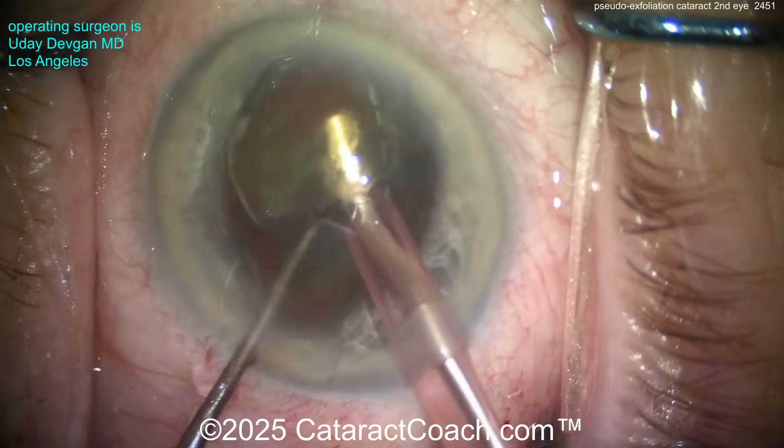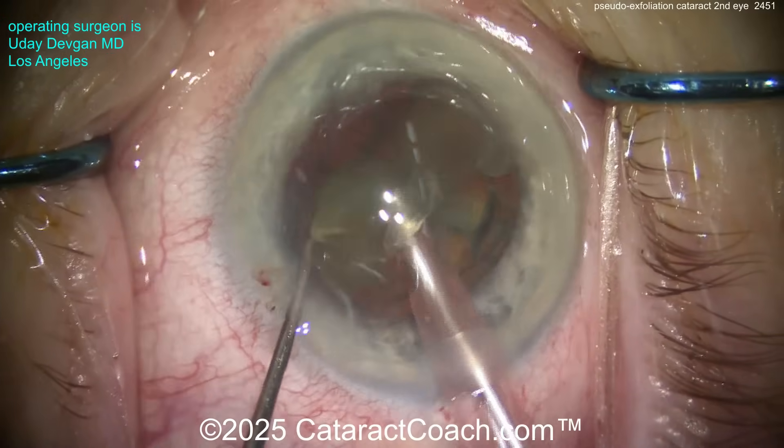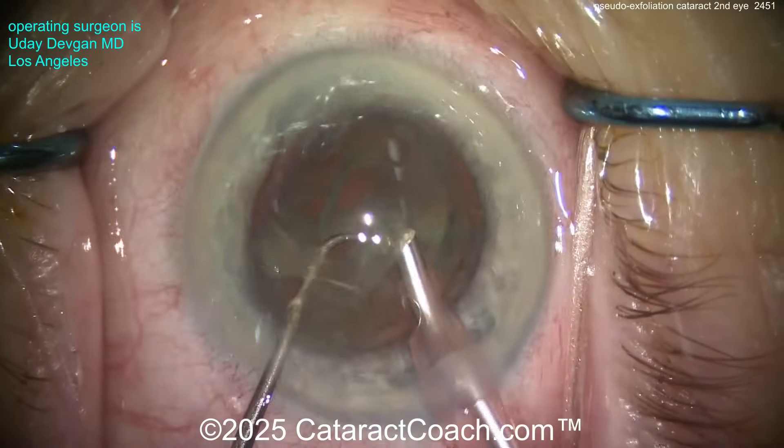Here comes a chop. Let's put that nucleus into two halves. This is a little tilt and chop — tilt it out of the bag a little bit and do a little chop. Not a very dense nucleus, so that's going to make life pretty easy, and we'll emulsify this pretty easily.